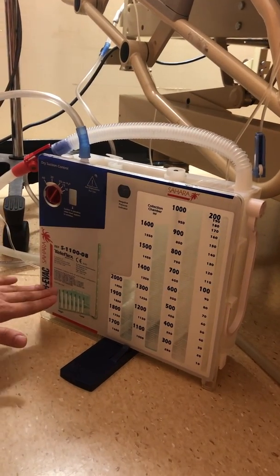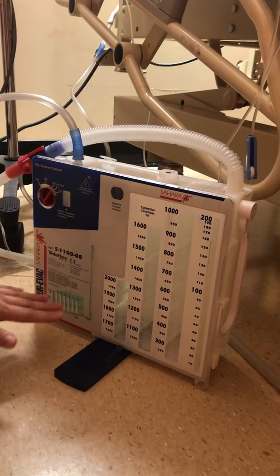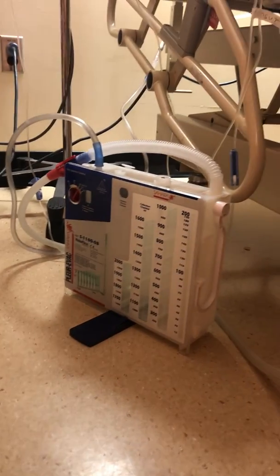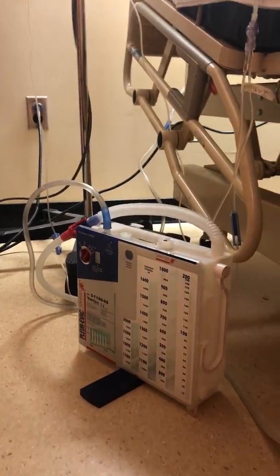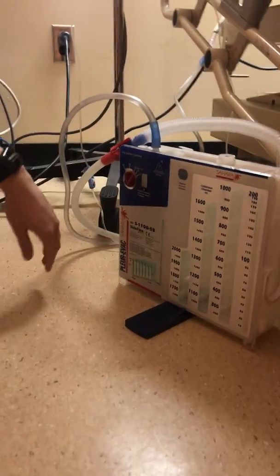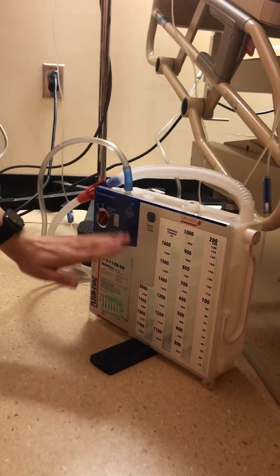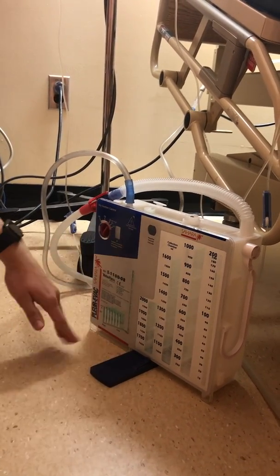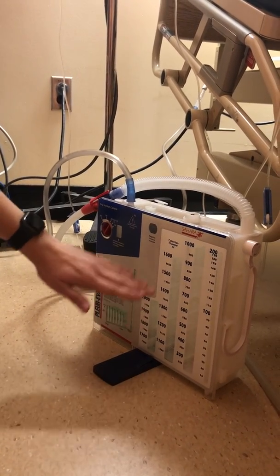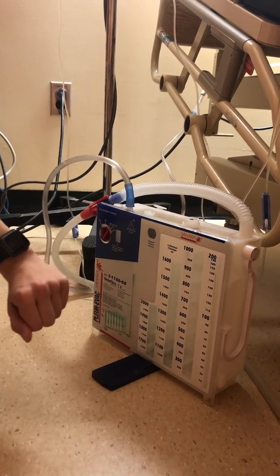I'm going to check here for any bubbling. If there was, that would indicate an air leak somewhere in the line, so I would use my emergency forceps there that I've checked that I have 2 of to clamp the line and look for that leak. I'm going to look here to see any tidaling. There should be, with his inhalation and expiration, some tidaling here, and I'll check the drainage to make sure there's nothing abnormal or excessive.